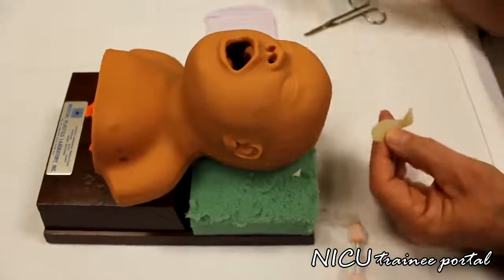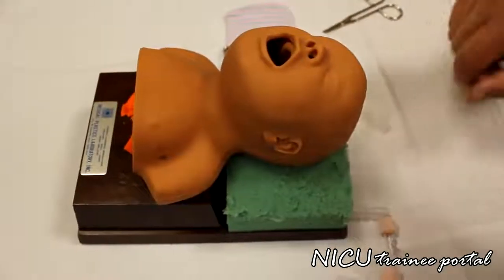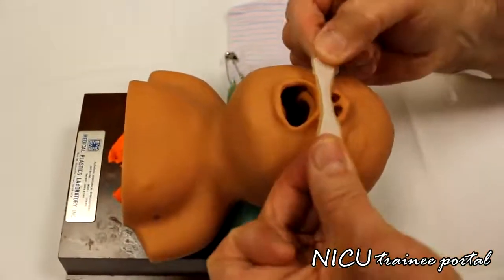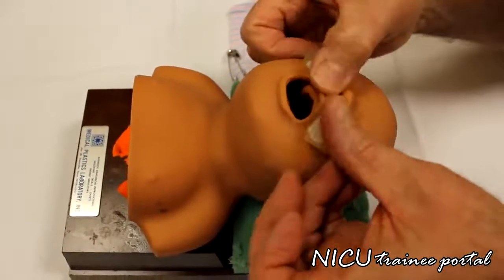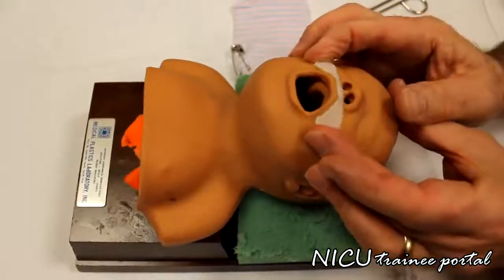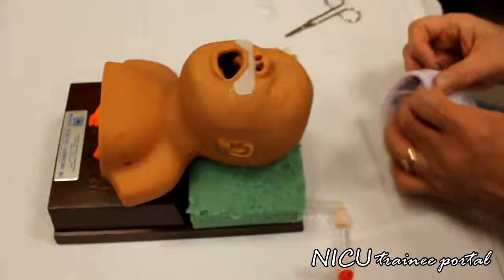And we peel the back of the Duoderm off, and we basically center it, and try to keep it away from the upper part of the nose. And we apply it all the way down. And then we're going to fit the hat on.